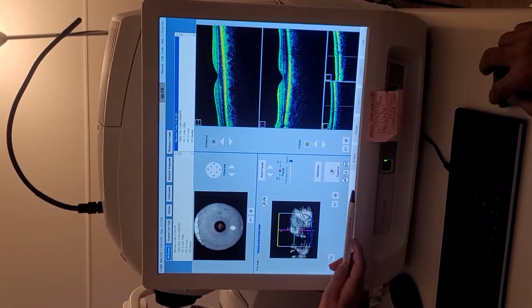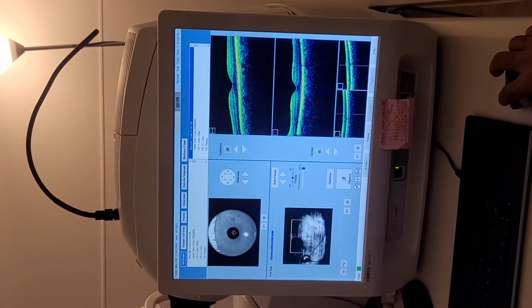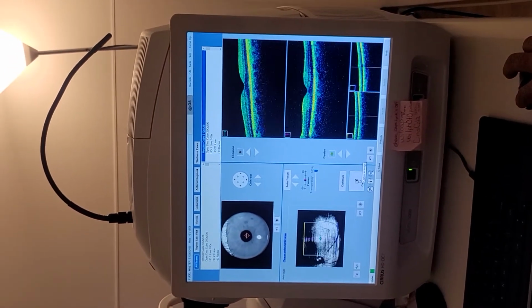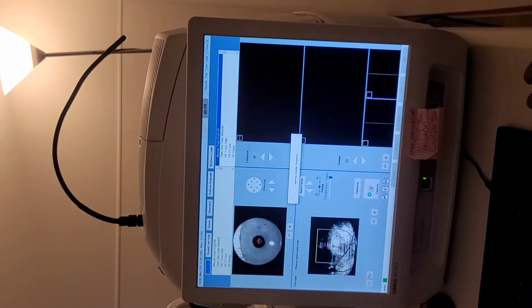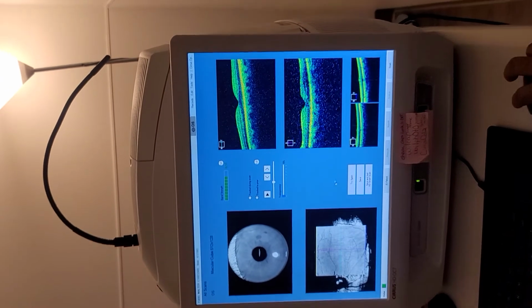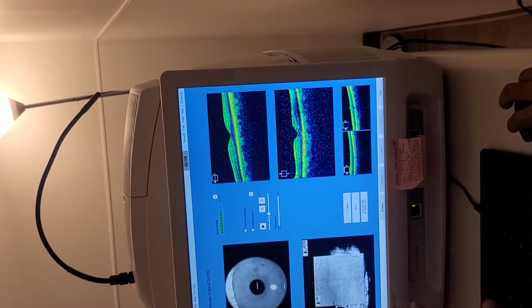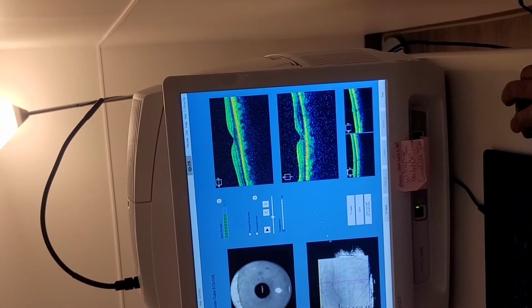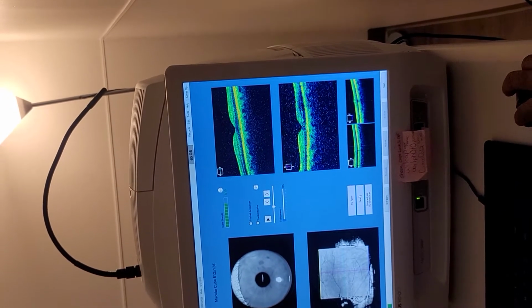Now that's probably pretty good. I would take it. Capture. Before you capture it, though, you need to say, "Don't blink, don't move," because they're going to move. But it is good, slightly moved. So you're like 8 out of 10, right? Yes. And save. Okay, go ahead and save it.